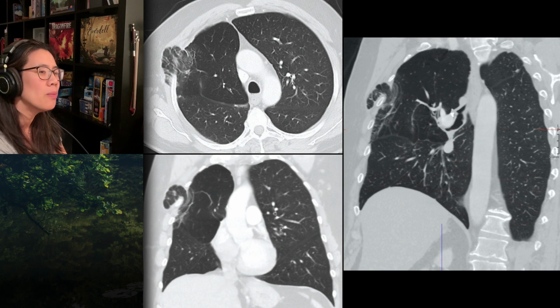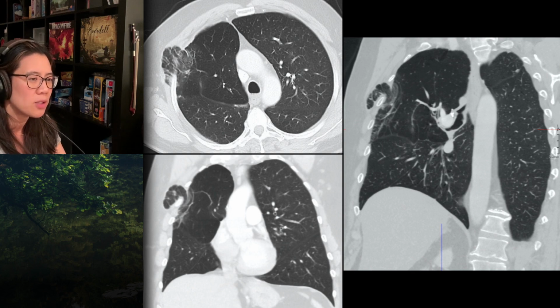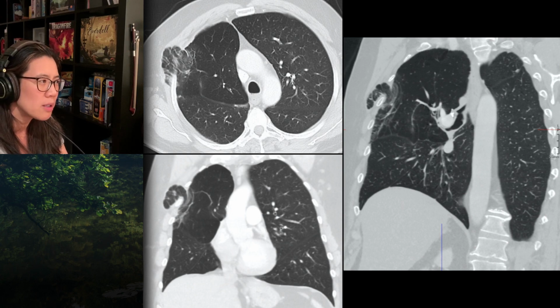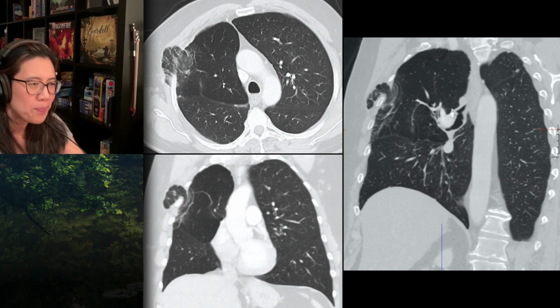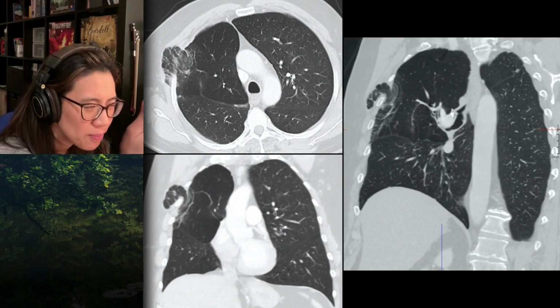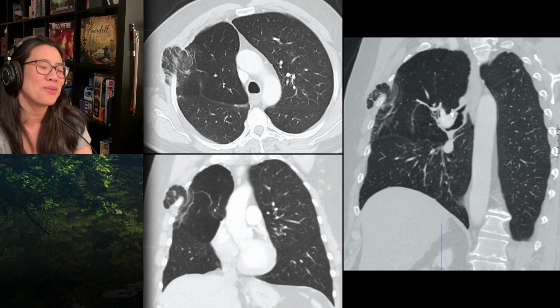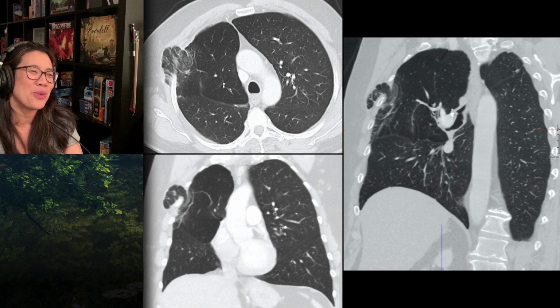Okay, so the right middle lobe, which is lying within the right superior chest, is hypo-attenuating compared to the remainder of the lung. It's got small vessels and it's too black. And the right middle lobe bronchus, which comes down off the bronchus intermedius under the right pulmonary artery, looks like it's got something in it, or is obstructed. No, it's just narrowed, because it's gone down and twisted up the top. You can get torsion of the middle lobe, but this isn't actually torted. It's just twisted over the right pulmonary artery, and the bronchus is narrow and he gets air trapping in it. Wow. Nice.